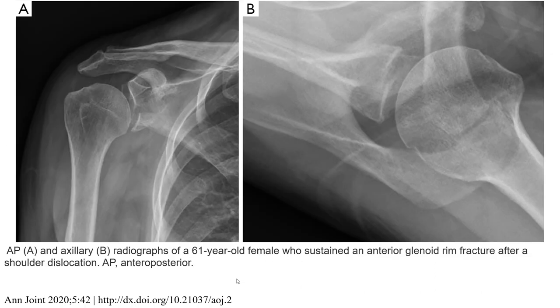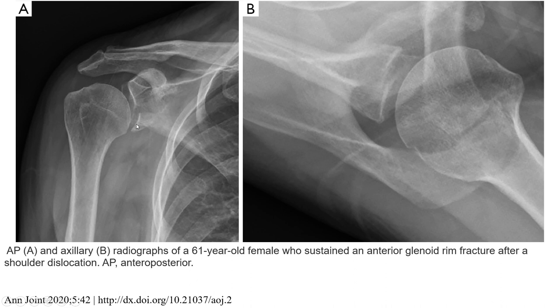First example of a glenoid fracture: Image A is the AP view and image B is the axillary radiograph of a 61-year-old female who sustained an anterior glenoid fossa fracture after shoulder dislocation. As we can see, there is a fracture fragment with a lucency line fracture with displacement.